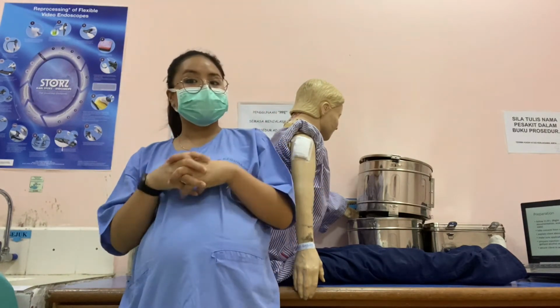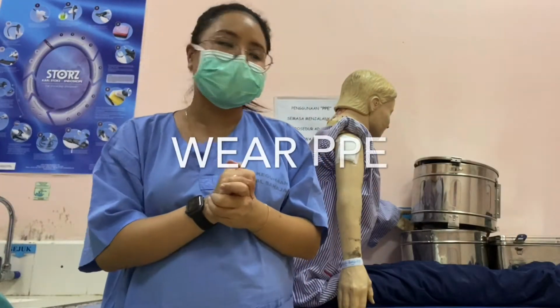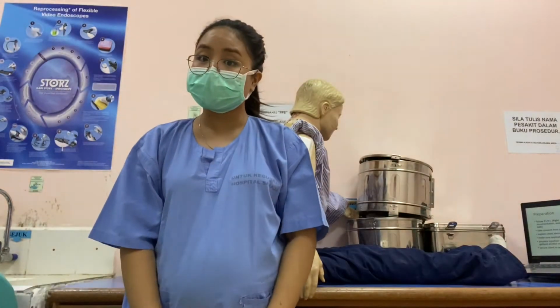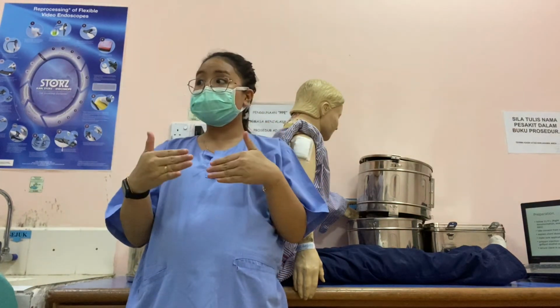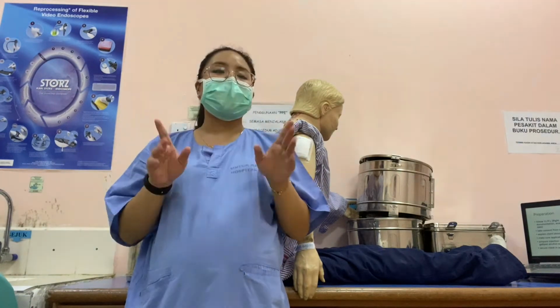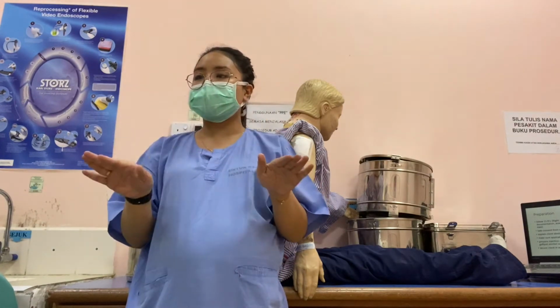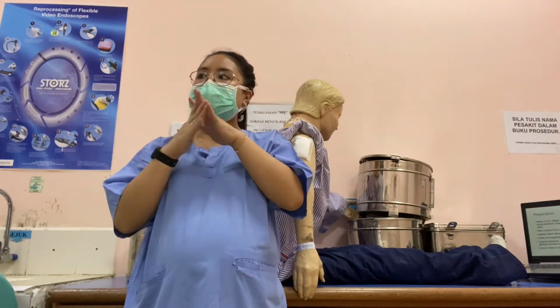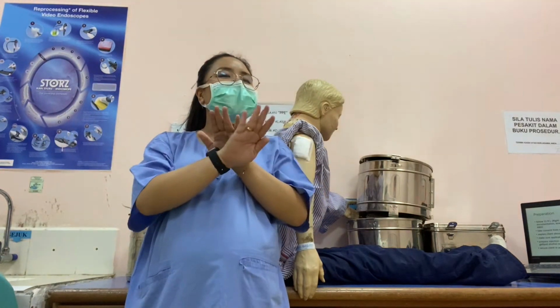Make sure of that. Then you must apply personal protective equipment, PPE, apron, and then wear gloves, because this is very important for anything that could happen between you and the patient. Personal protective equipment should be applied whatever the situation is, whatever the patient is, even if the patient is clear, or you know that he or she is clear from any other disease.